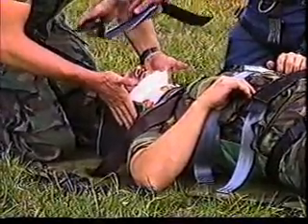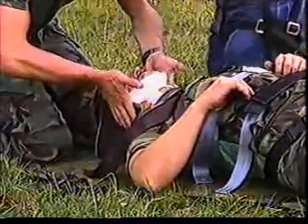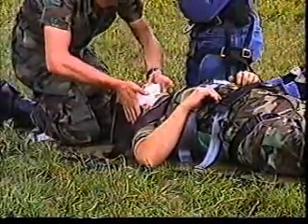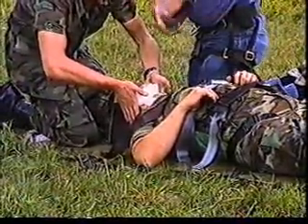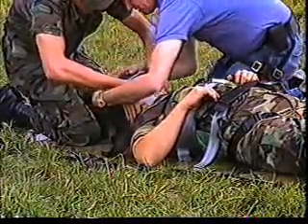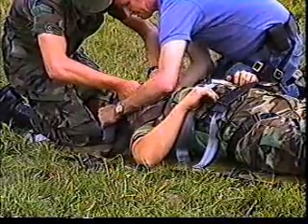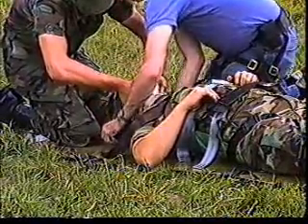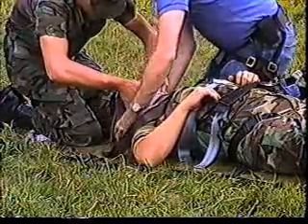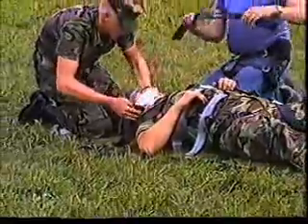Okay. At this point, I'll place the forehead strap. If there's a little extra material sticking over, put that down by the nose. It's wider than the strap. So, okay, get it over the eyebrows. When you pull back firmly, slightly downward, but not much. Okay, now the collar strap.